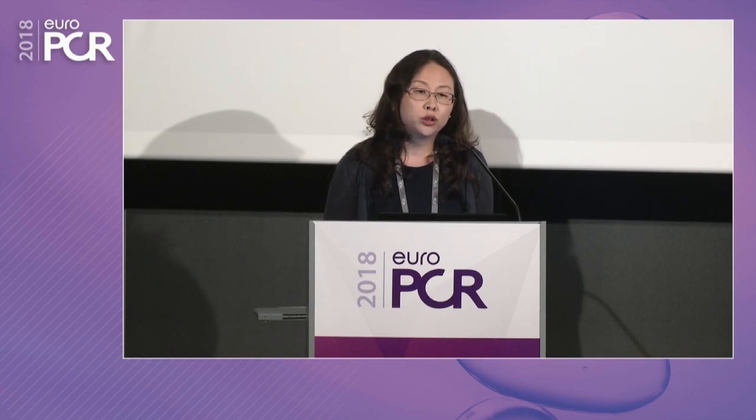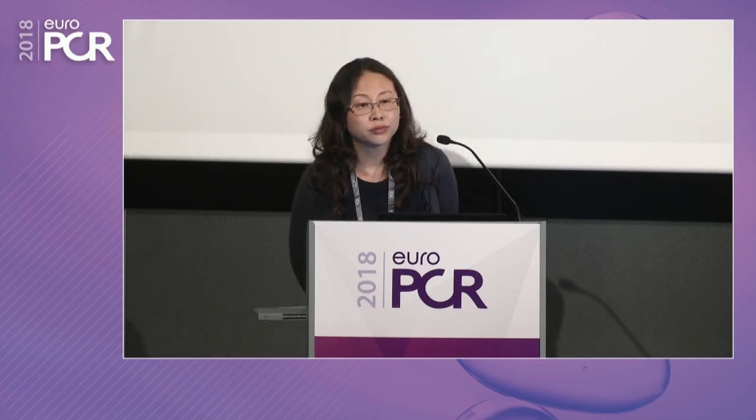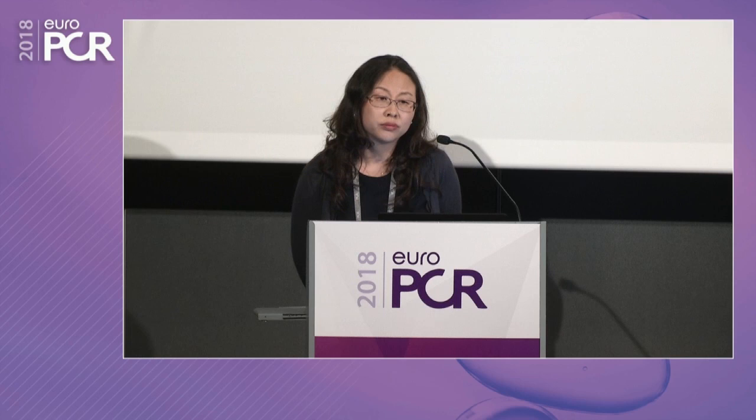What was the size of each one? Oh, 3.5 and 2.75. I think if you had a larger balloon available, you would probably have used it. It doesn't have to be a non-compliant balloon either. You could use a compliant balloon for the final POT. Yeah, I agree, but anyway, I checked the IVUS afterwards, so the stent expansion was very good.